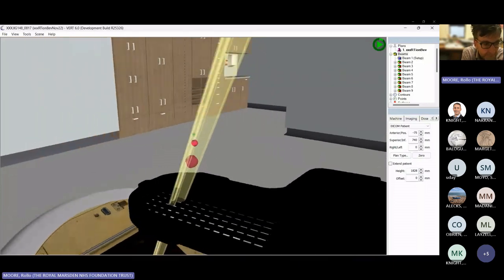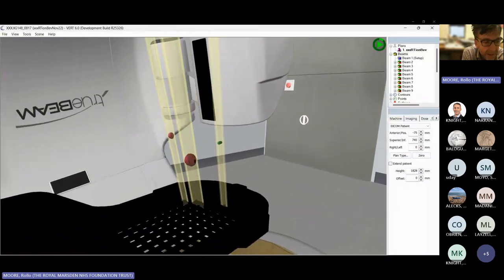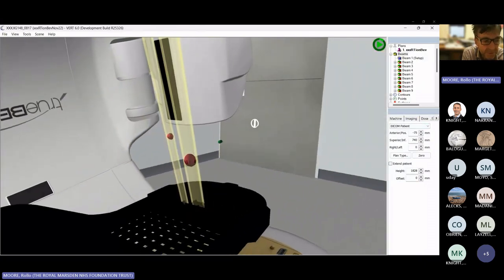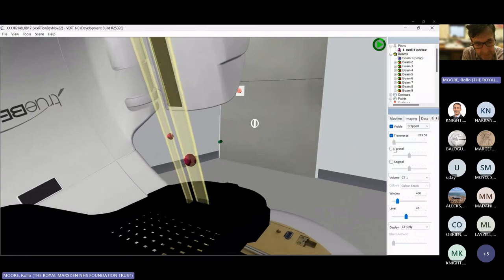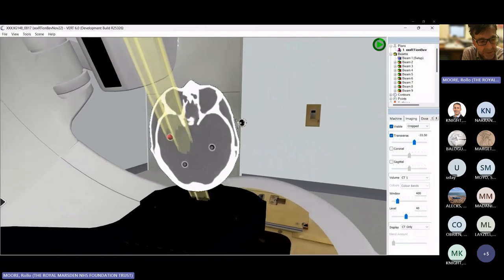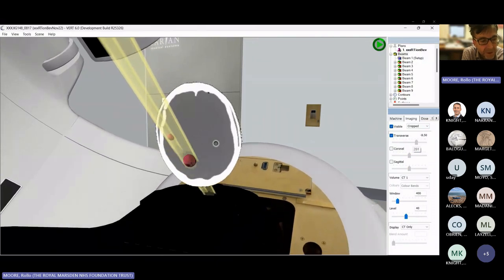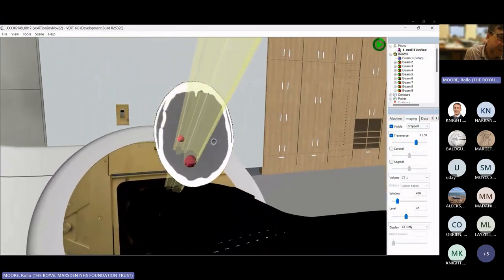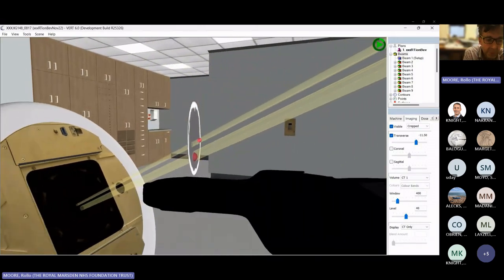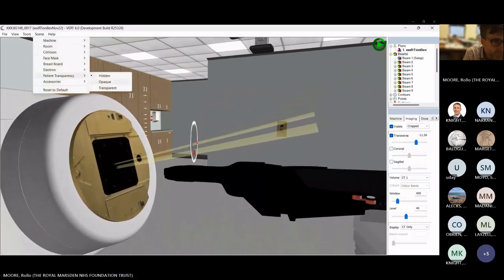high dose delivery ability. So the software has now made the patient disappear, and what we're looking at now, suspended in space, is the brain met lesions themselves that we want to restrict the dose to. And in this style of radiotherapy, the CT scan is coming there to show the representation of where the radiation beam interacts with the lesion, and illustrating the way in which this software is useful in both tuition and for planning the radiotherapy from an oncological point of view.